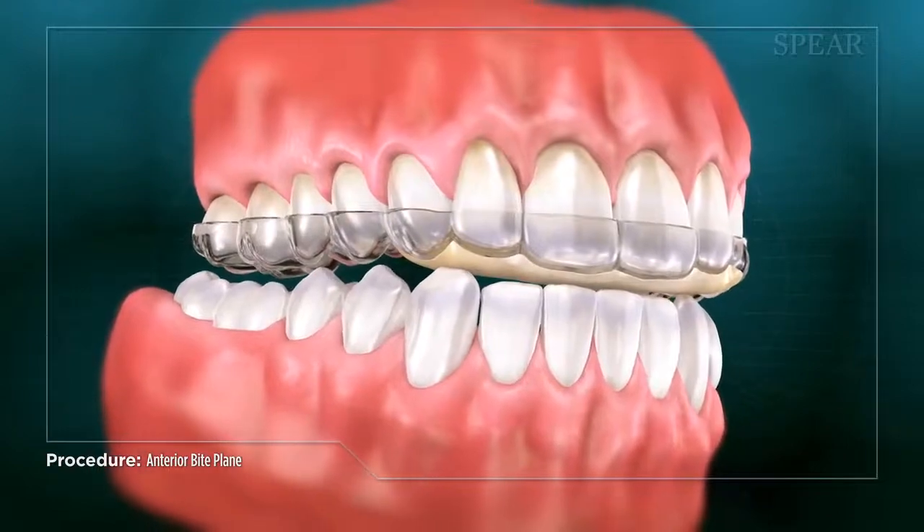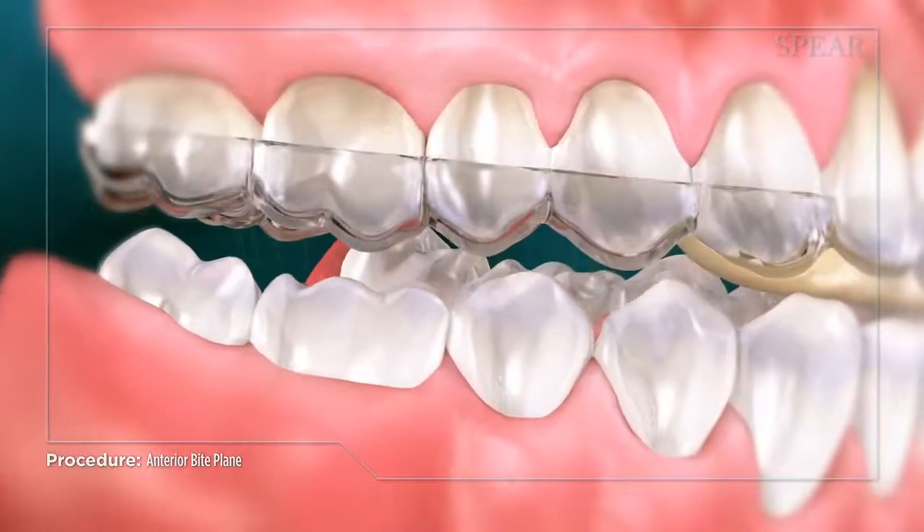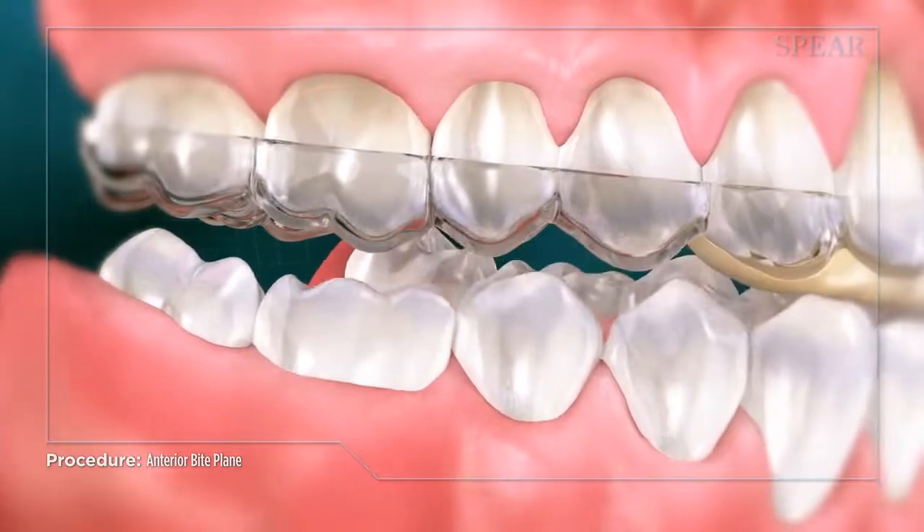While creating a platform for the front teeth to touch, the appliance prevents the back teeth from touching, protecting them from wear and minimizing stress on the jaw muscle.